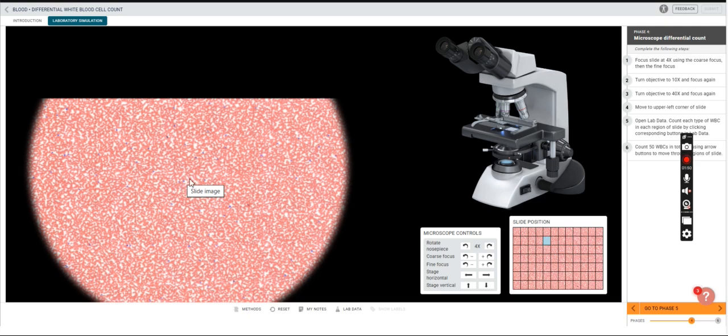We stain cells before you put them on a slide so that they're a little bit easier to see. As you can see, the other ones are red blood cells. Those aren't as interesting to us in this simulation, but they could be interesting in other simulations. We are focused more on the white blood cells, but one observation right away is that red blood cells are a lot more numerous than the others.